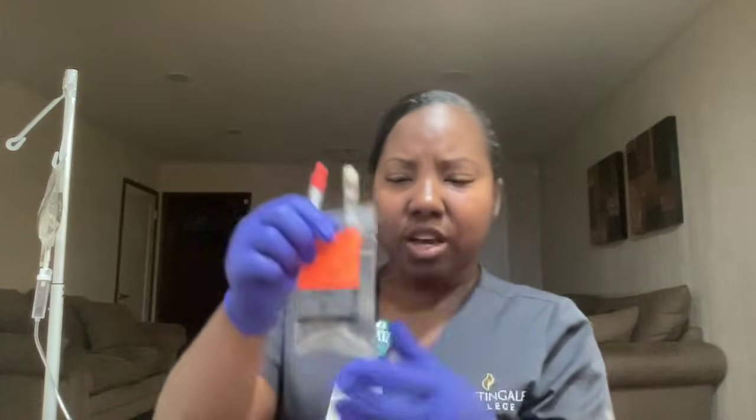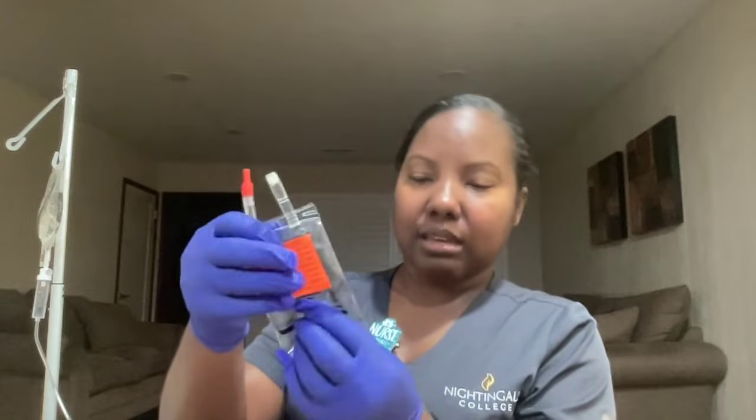Next, we will get the antibiotic ready. So when getting a bag, you always want to make sure that it's not cloudy. You want to check the expiration date. You want to make sure that the patient information is correct. And then it's important, I would do the 6 rights of medication administration again. I will also double confirm that the patient does not have any allergies to this medication.